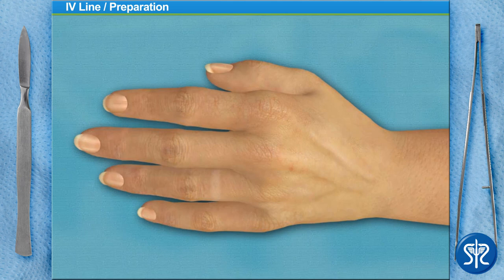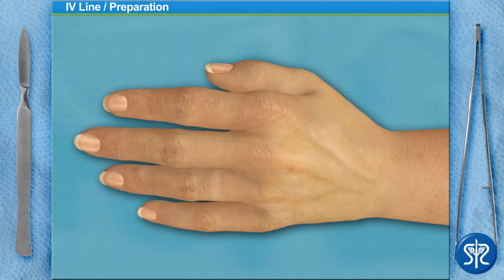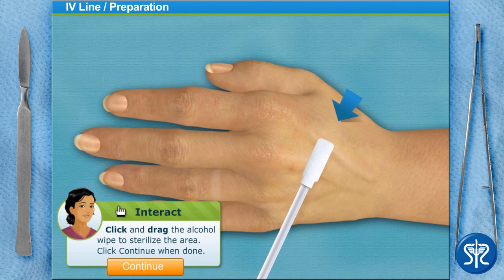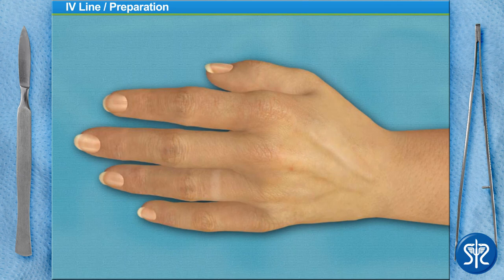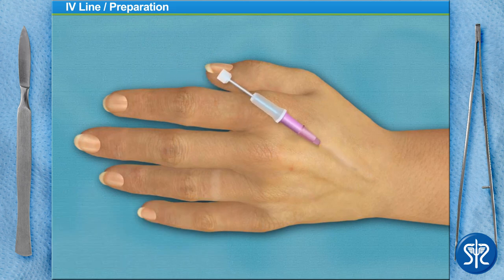I've already tied a tourniquet around her upper arm. Can you find a suitable vein in the patient's hand? Wow, that's a big one! To begin, sterilize the insertion area using an alcohol wipe. Insert the needle and advance the angiocatheter into the vein. The small burst of blood that just appeared in the angiocatheter hub is known as a flashback — this lets us know that the angiocatheter is correctly positioned in the patient's vein. Now I'll release the tourniquet. While applying gentle pressure over the vein to collapse it, you can remove the needle. This will reduce the amount of blood that may discharge out of the angiocatheter when the needle is removed. Once you remove the needle, it will be properly disposed in a sharps container.